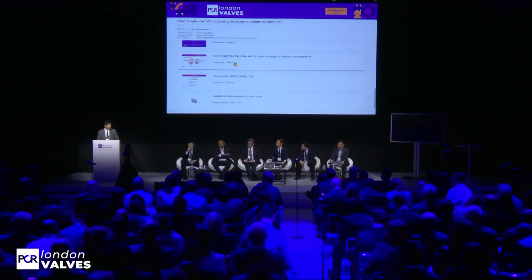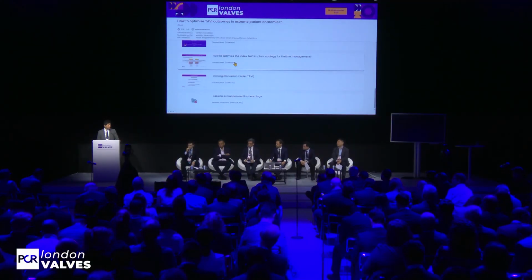Thank you, Kentaro, and great presentation, Yusuke. As he emphasized, I think the appropriate depth of the index procedure is very crucial for coronary access, of course, and for future redo TAVI. If the hemodynamics are not compromised, I always try to go slightly deeper, but still without causing a conduction disturbance.